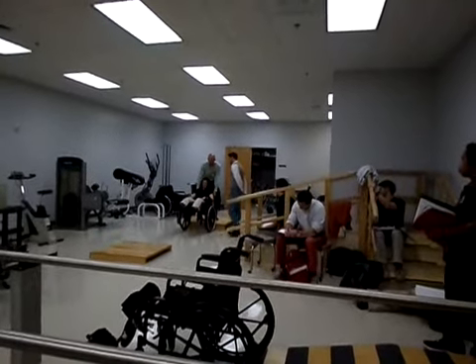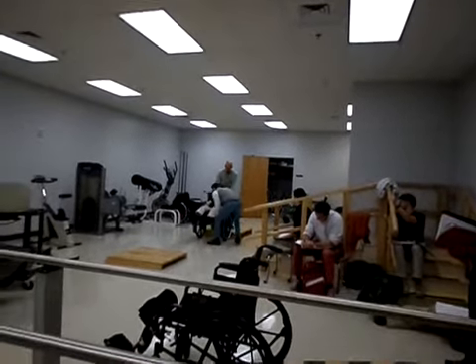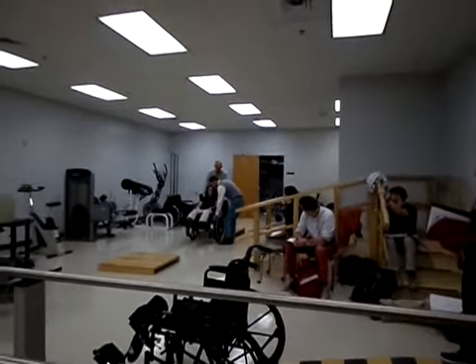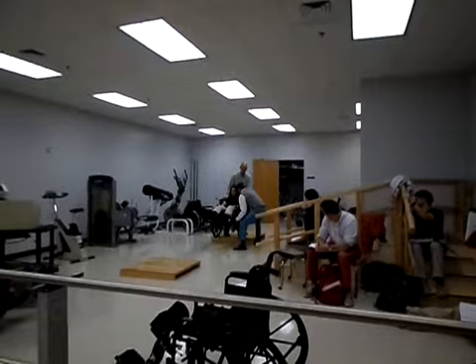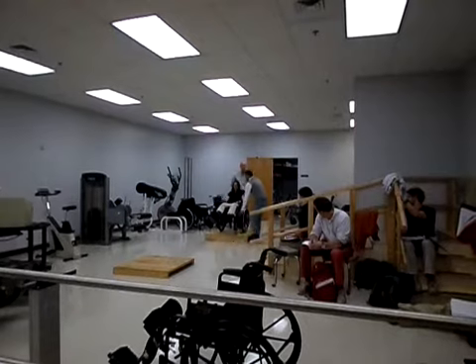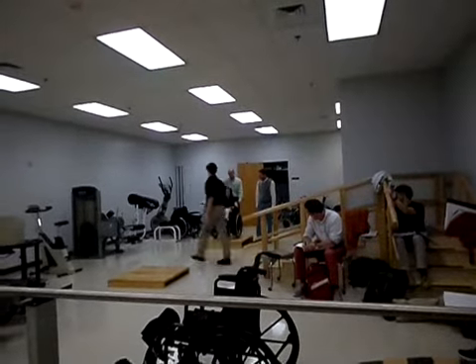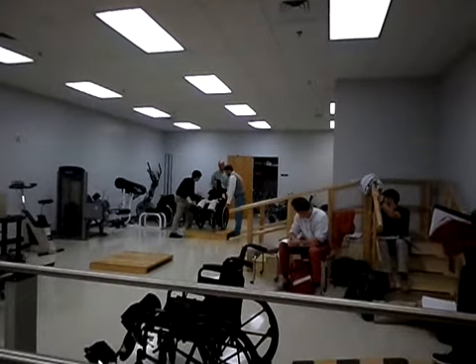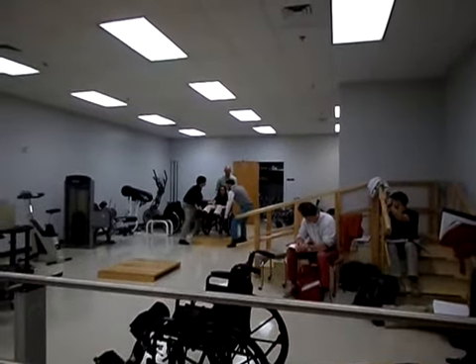All right, Jay, can you find a good place to grab, please? Yep, let's do one side. Okay. All right, I'll tell you what, put one hand there and put one hand over here. Good body mechanics. Great, ready? 1, 2. Oh, that was a lot. Okay, but still not enough. Set. Come on over here. And why don't you grab the other side? Same sort of thing. Let her down nice and gently, okay?